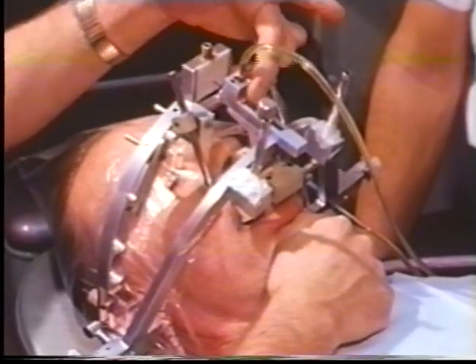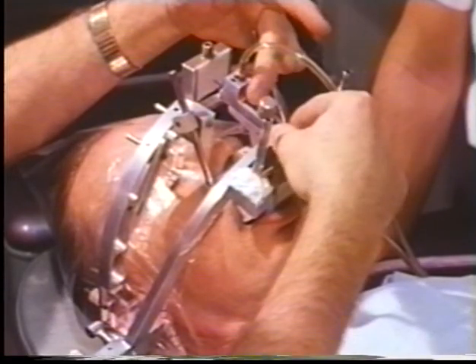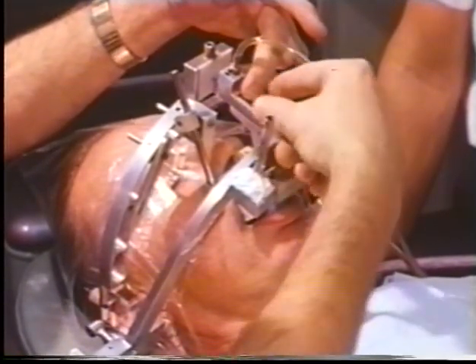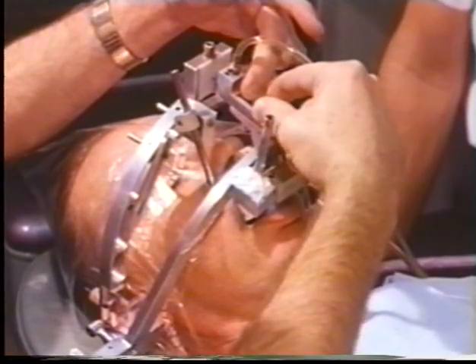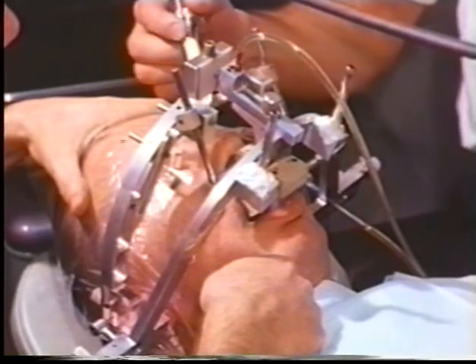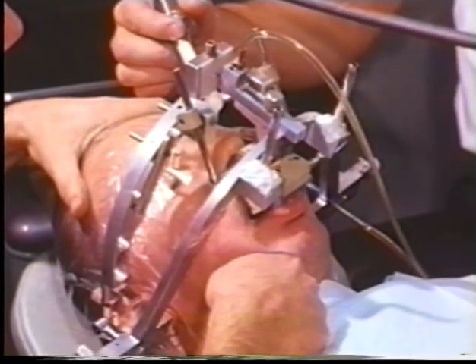With the mandible in centric relation, the anterior drill is activated and inserted into its recording block. It is locked at a depth indicated by a scale on the side of the turbine carriage. The left lateral border movement is recorded with the drill engraving a three-dimensional pathway.